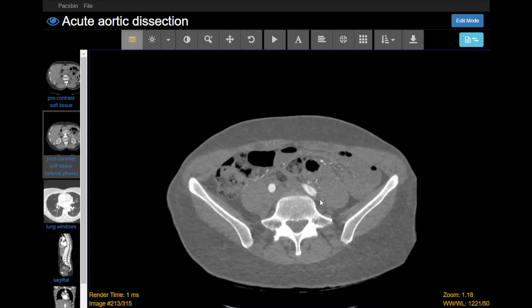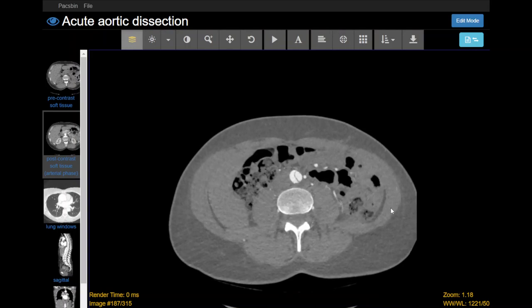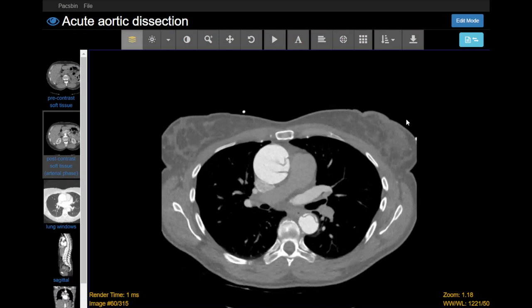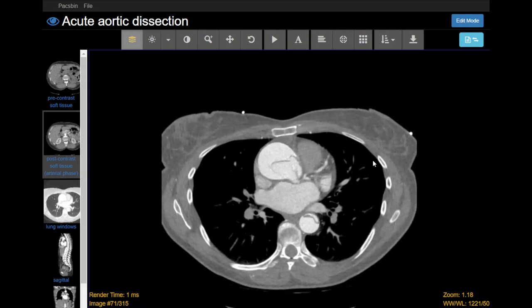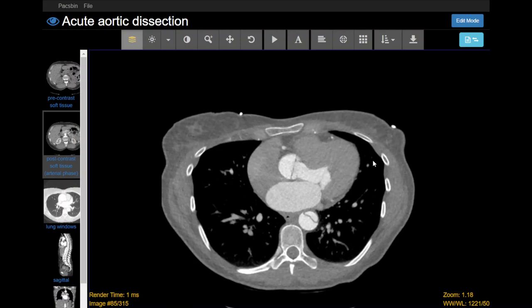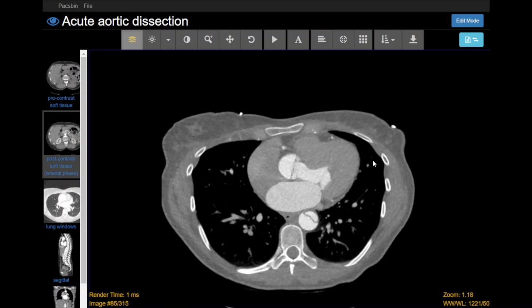You want to describe exactly where you see the flap and which vessels are opacified. The main complication we really worry about is the dissection flap occluding one of the important branch vessels — fortunately, that was not present in this case. That being said, a type A aortic dissection is a surgical emergency and should always be addressed immediately. Take-home points: define your true lumen and your false lumen, figure out if the branch vessels are open, and determine if they're arising from the true or the false lumen.